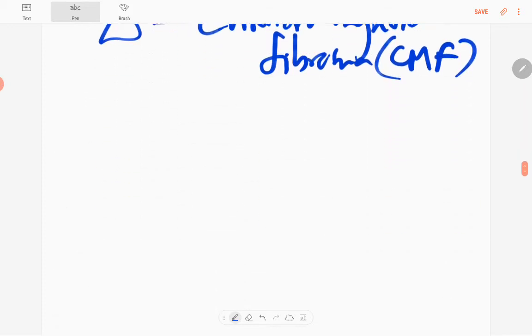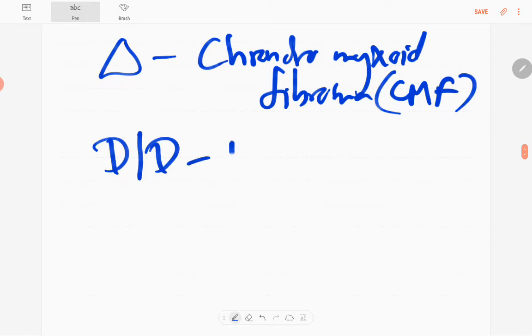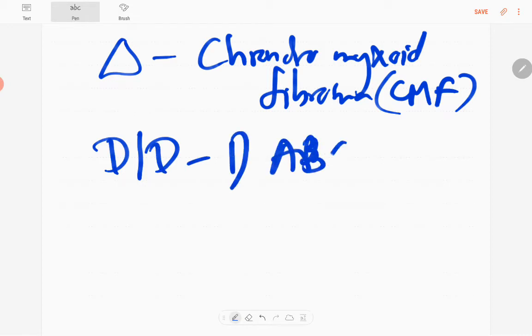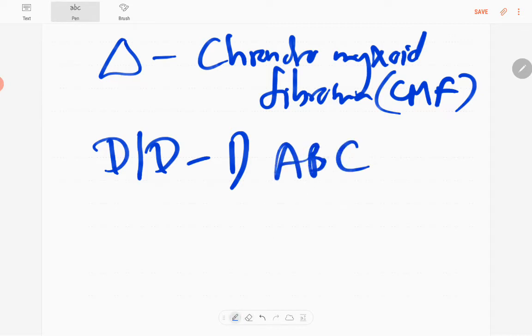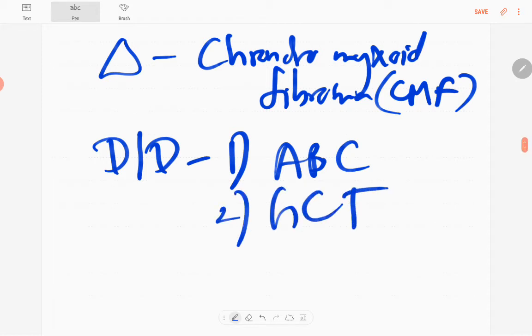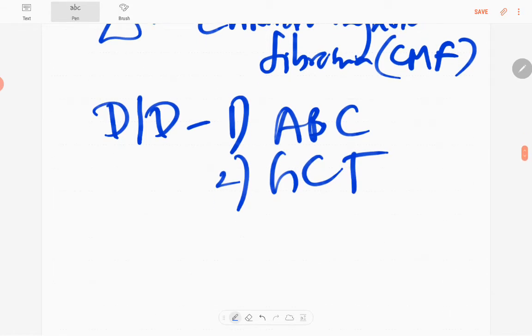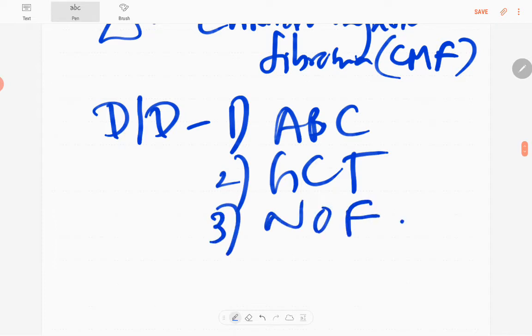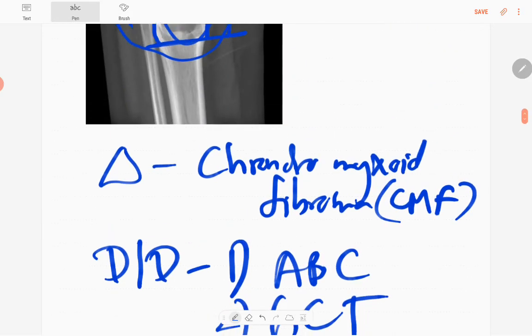Differential diagnoses include aneurysmal bone cyst, giant cell tumor, and non-ossifying fibroma. These are the three main differential diagnoses.